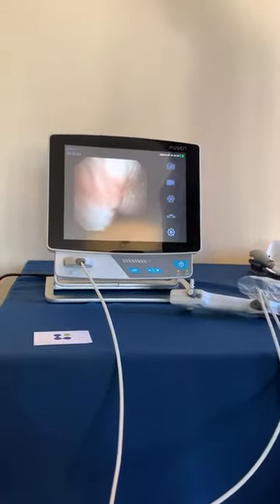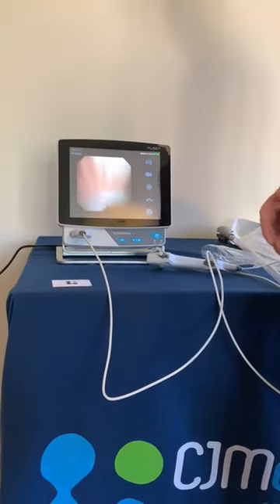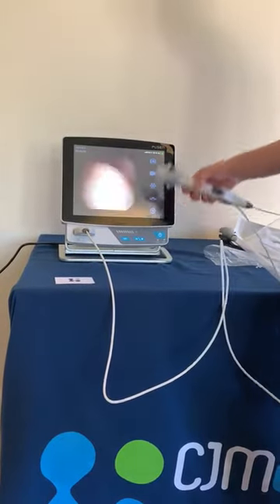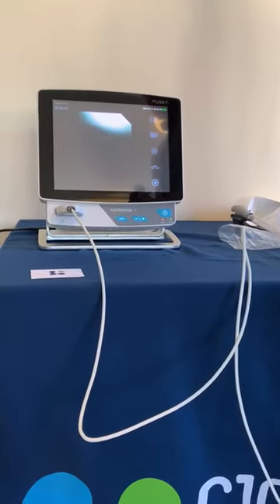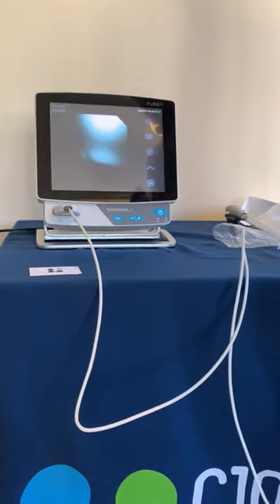That's the device. As you can see, it's a very simple plug and play system that allows you to do a scope anywhere in the hospital — really simple. Any questions, you can call customer services on 0203 198 2420 or visit the website at www.cjmedical.com. Thank you.